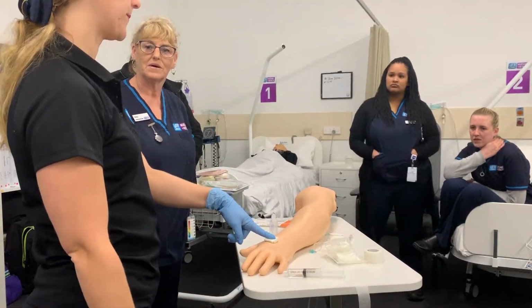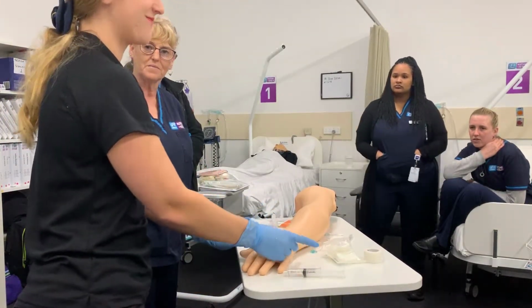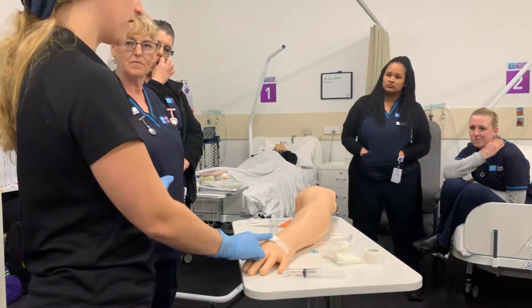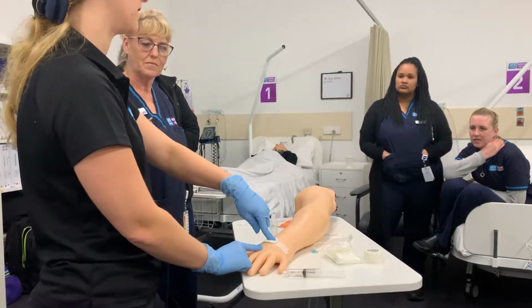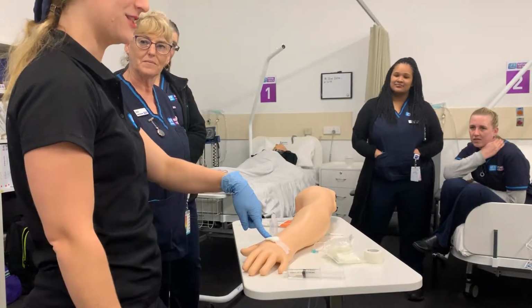So what can I do? So I can tape it. Get the patient to hold it. That's right, because tape is not enough pressure. So then you take the patient's finger and you say, can you hold pressure? You'll need to put their finger directly on it because a lot of them will be like, okay. And then they hold the edge weirdly.